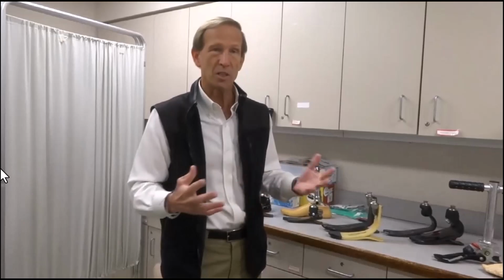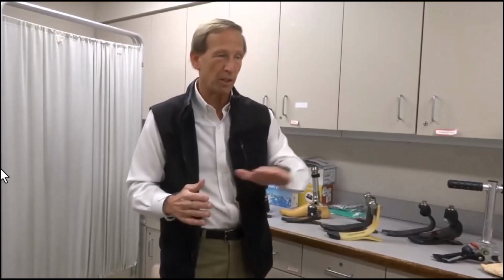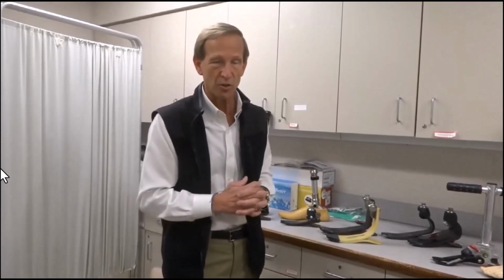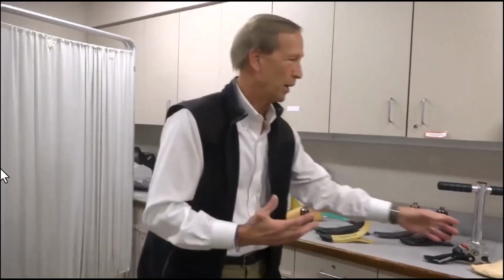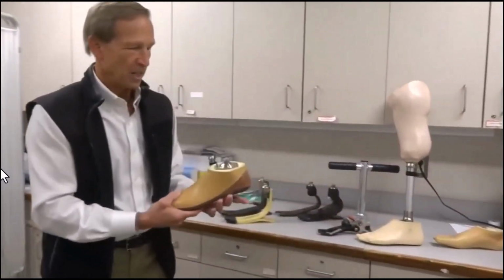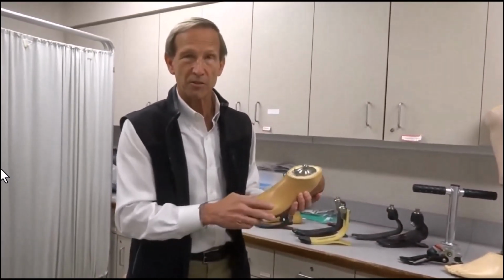For the lowest level of patient that's only going to be walking around in their house on a level surface, that's basically what we call a category 1 patient. They can get a very simple, very lightweight, and yes, very inexpensive type of foot. Now that might be a simple one that is literally a wooden block covered in foam.